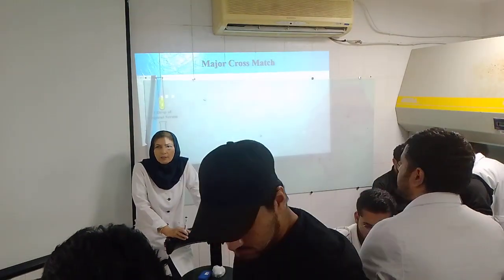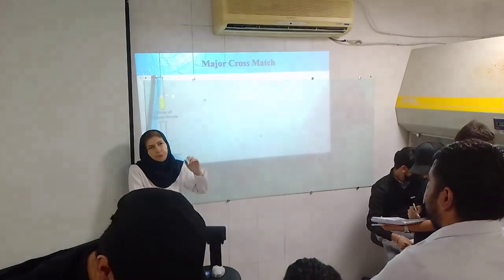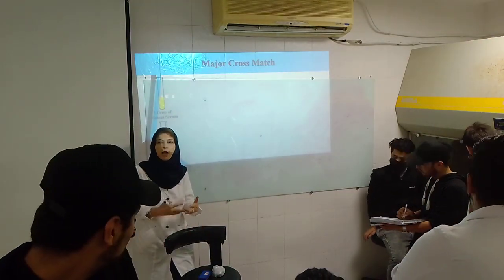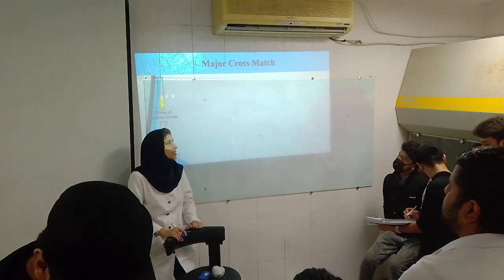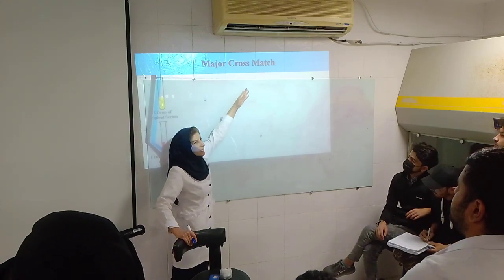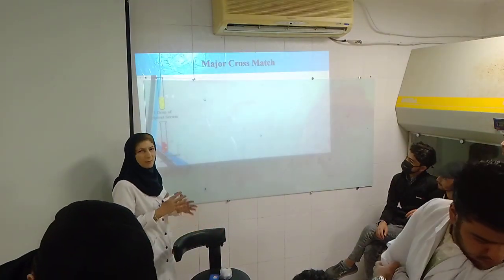Before every blood transfusion, we must do direct and indirect methods, ABO blood group typing, as you have done it. But after blood group typing, but before blood transfusion, again, we must do another test that we call cross-match. Maybe you have heard about that or you read about that in some text.